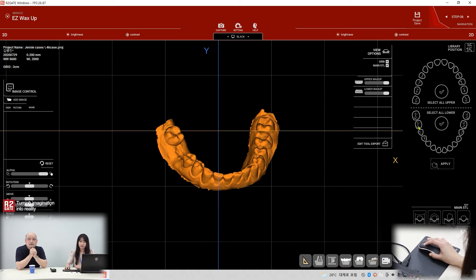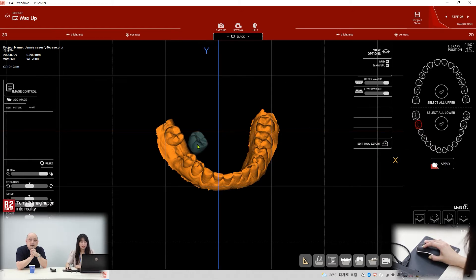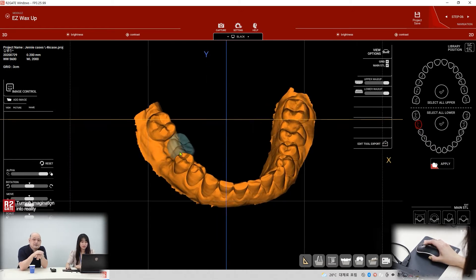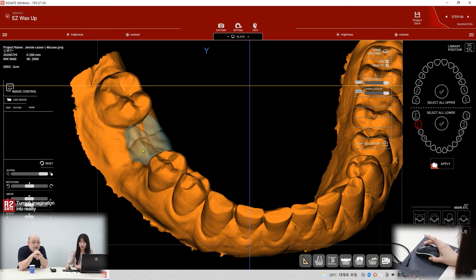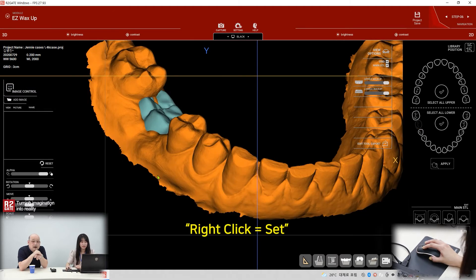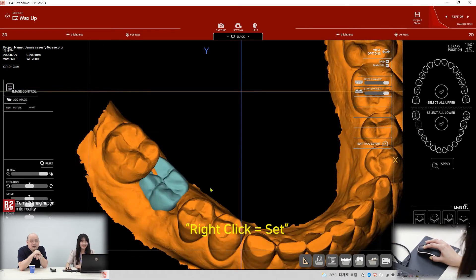So I have the tooth number. Apply. And there's the tooth. Located? Right click. Set.